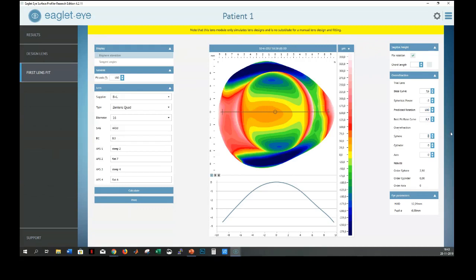And now you only have to do your over refraction. So let's say you measure -3. And down here you find the results, so the values you need to order the lens. Nice. Any questions about the last two examples? And I have one more to go. That's a new feature. Hopefully we're going to roll it out at GSLS, but yeah, that's cool. We will.